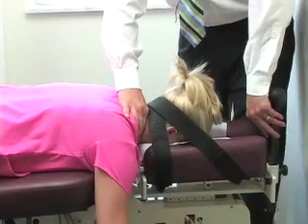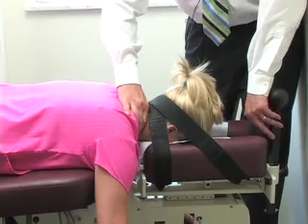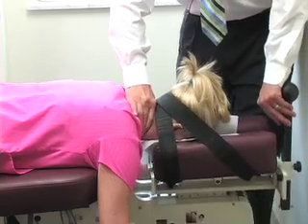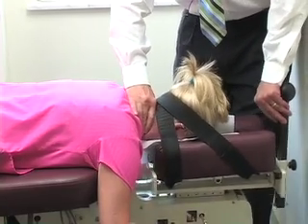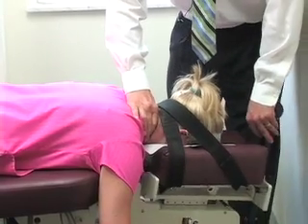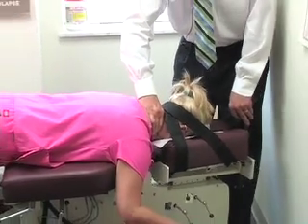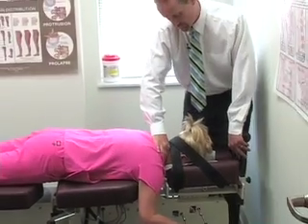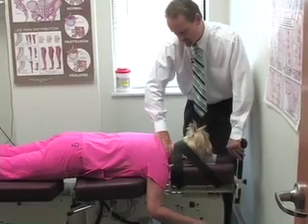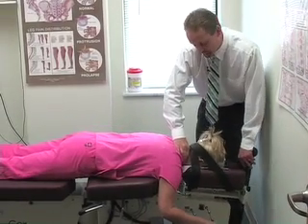This aspect of the table allows us to apply the similar procedure to the cervical spine. This lets us treat bulging or protrusions of the cervical intervertebral disc, decreasing the interdiscal pressure and reducing those. It also is very effective for stenotic conditions from degeneration, whether it's IVF stenosis or even canal stenosis with cord myelopathy.